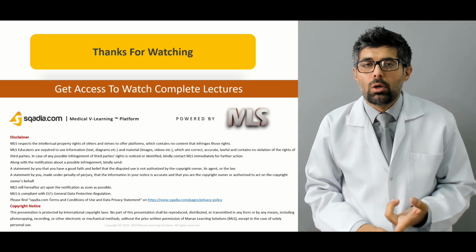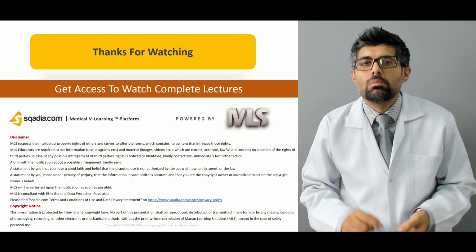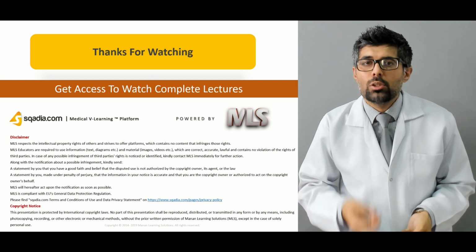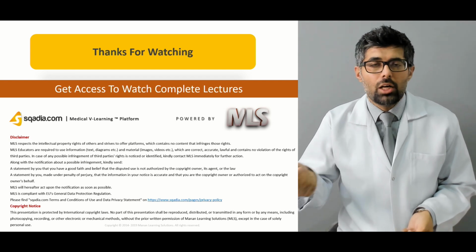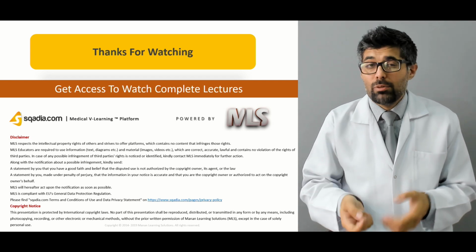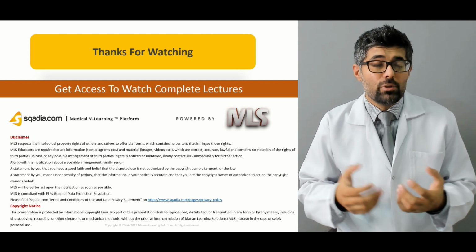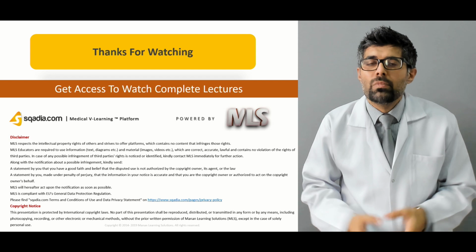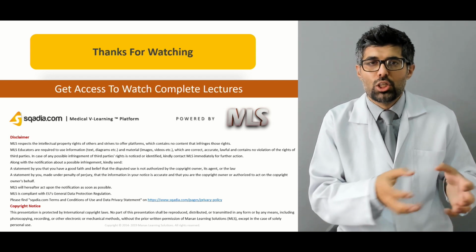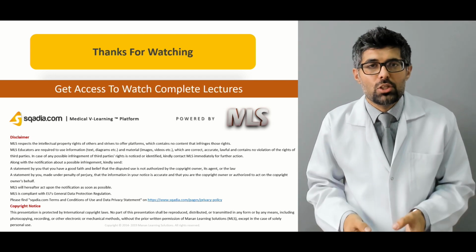First, we studied trauma to the urogenital system, and which modalities to use to confirm and diagnose it. Either we use radiographs, or we use CT scans. If we use CT scans, then we use contrast enhanced CT scans. If we use magnetic resonance imaging, we studied which modalities are used in which condition and which conditions do not require any imaging.